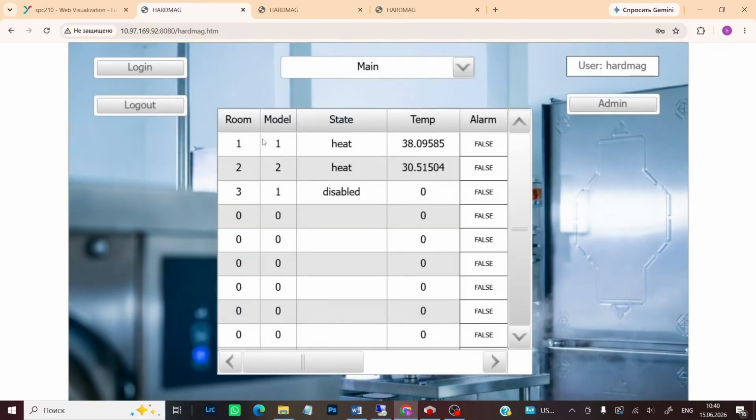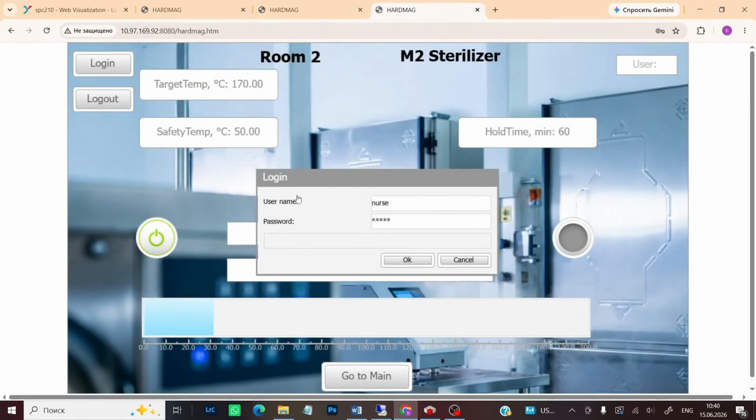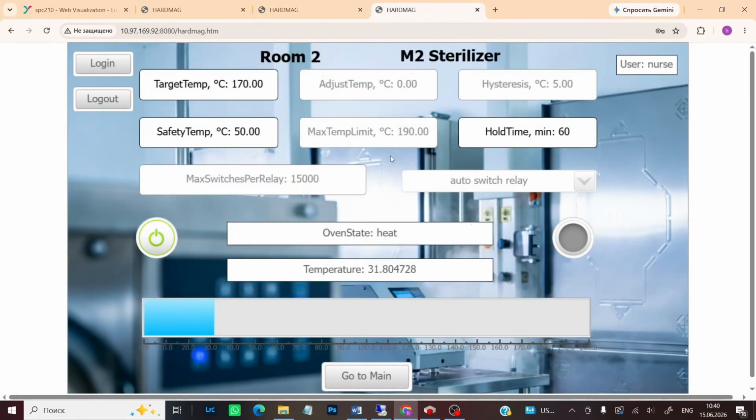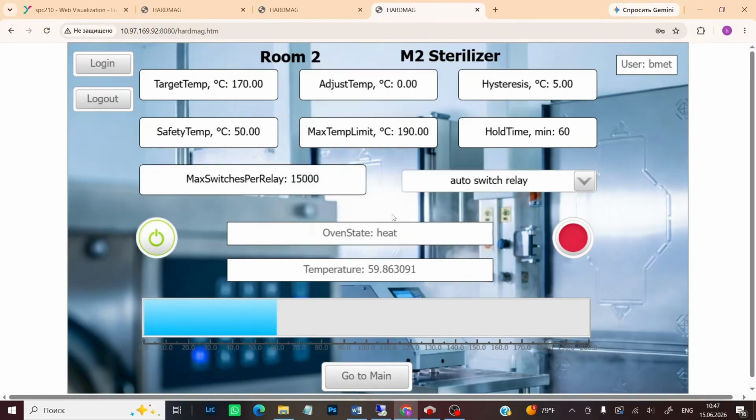With one browser client, I logged in as administrator. With the second client, I logged in as BME. And with the third client, I logged in as nurse. On the third client, when I click the Login button, I can log in as BME and manage additional sterilizer settings. If I had left the setting Change to Start Visualization when logout enabled, then when logging in, the previous user would be logged out first.